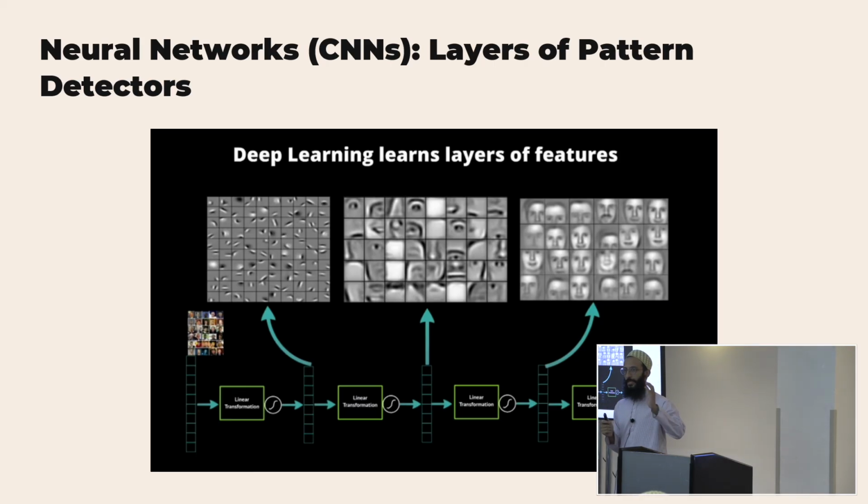And so that's why neural nets need so much time to train, so many images. What's interesting about images, we won't go too far into this, but because there's so many pixels, the neural networks are trained on pixel level almost, rather than images. I can go down a rabbit hole there, I'll stop there, but that's effectively how they learn.